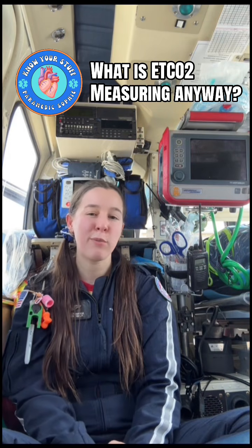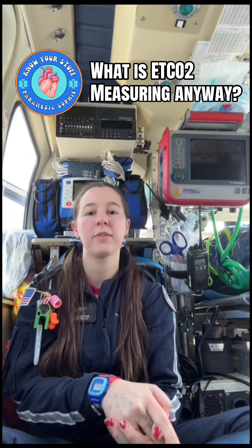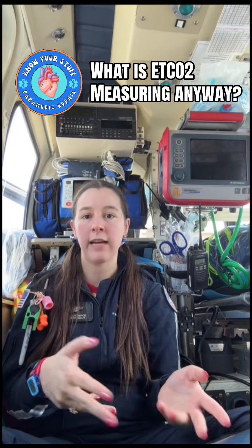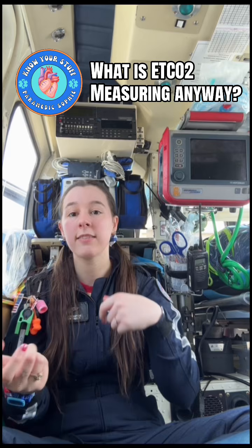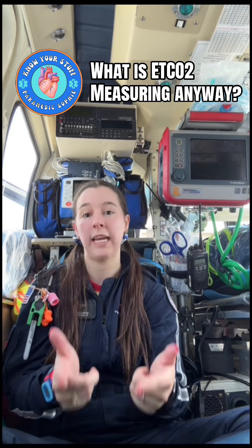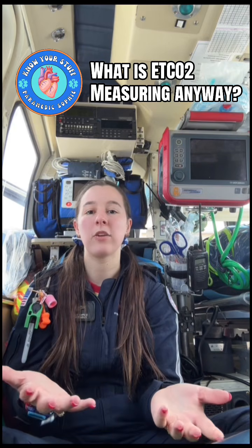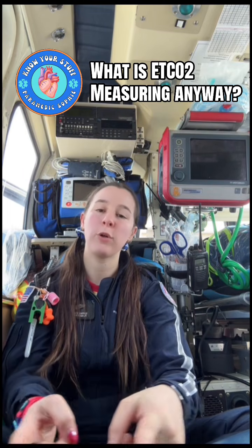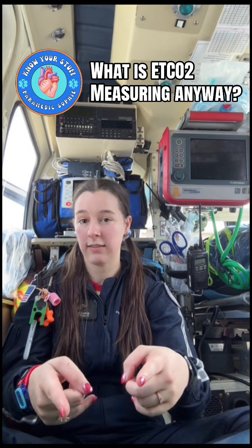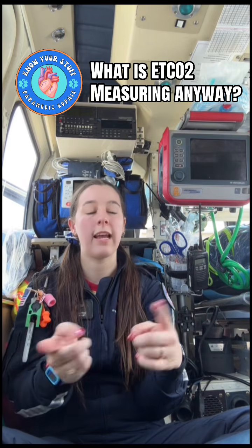From a physiological standpoint, end-tidal is closely tied to cardiac output. If blood flow to the lungs drops, less CO2 gets delivered to the alveoli and your end-tidal falls. That's why in low flow states like shock or cardiac arrest, you'll see low numbers. On the flip side, if ventilation decreases, CO2 can't be blown off effectively, so end-tidal rises. And then if metabolism increases, like in fever or agitation, you're producing more CO2, which can also push that number up. So when you look at end-tidal, you're really looking at the balance between CO2 production, transport, and elimination.